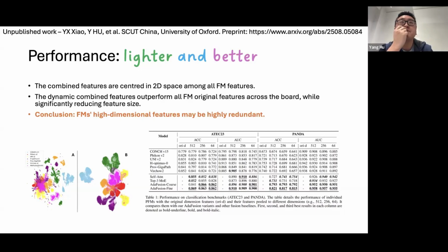From my experience, when I've looked at those, when I used accuracy and AUC, because of the high imbalance between the positive and negative samples, you tend to get very high numbers in these two metrics. But when you look at, for example, AUCPR, that metric would be really differentiating between what is a good and what is not a good predictor.